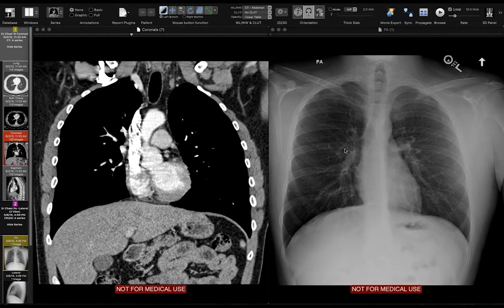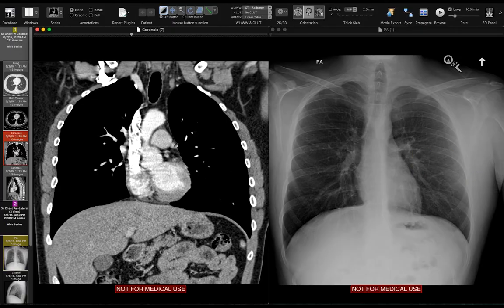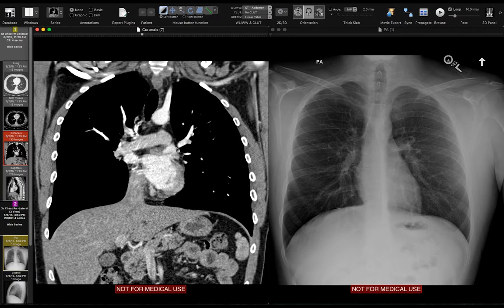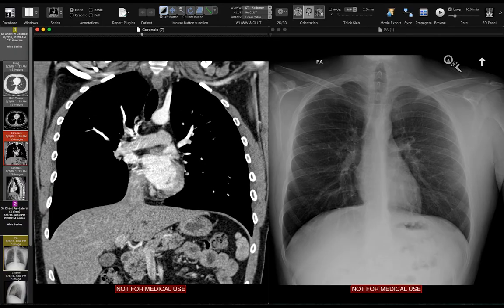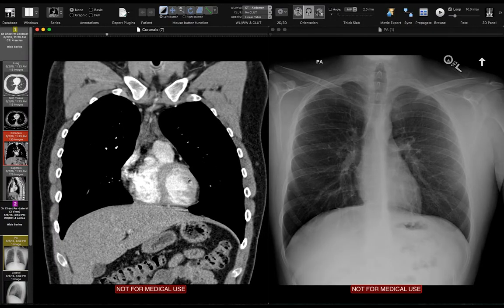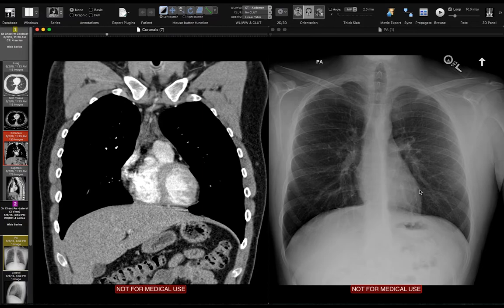The next structure I look at after the pulmonary artery is the left atrial appendage. The left atrial appendage forms the border with the lung — this is the lung, this is the left atrial appendage. Scrolling forward, the next structure is the left ventricle, going straight down from the left atrium. So to sum up the left-sided border of the mediastinum, we have the aorta, the AP window, the pulmonary artery, the left atrial appendage, and the left ventricle.